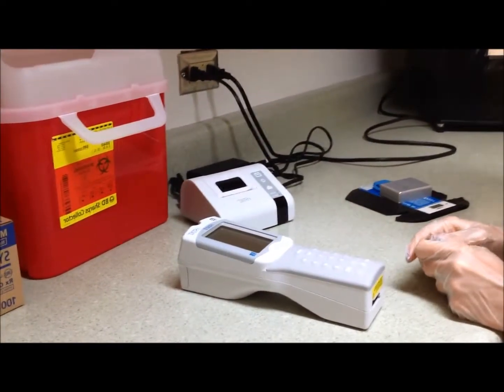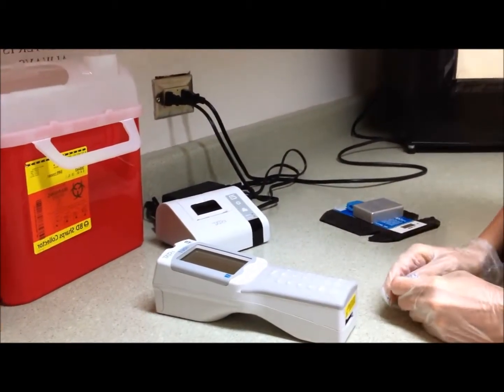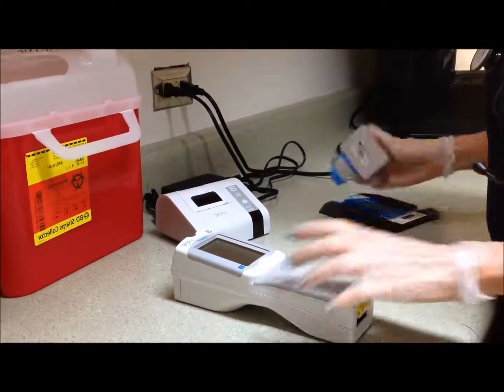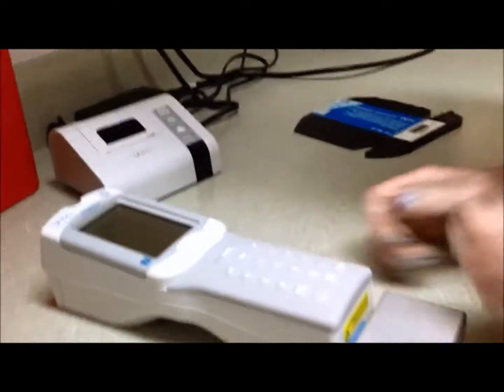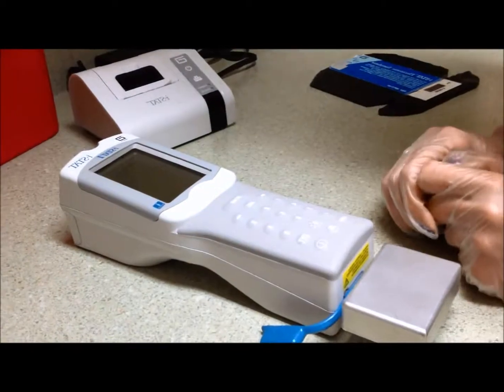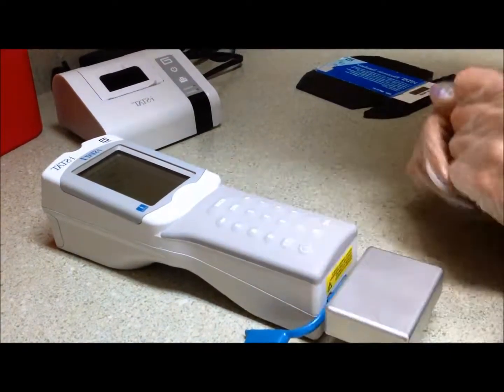Hello, today I'm going to be showing you how to run the iStat quality control as part of the Lead Tech daily procedures. The first step we're going to go through is to turn the handheld on, and you're going to press number 2 for the simulator. Insert. You're going to enter your operator ID, which can be found in the iStat room here. And that will be entered twice. Since we're doing the simulator, there is no patient ID, so enter twice.